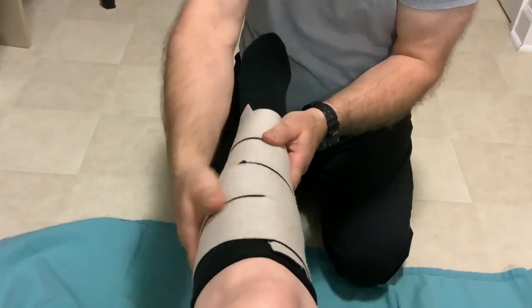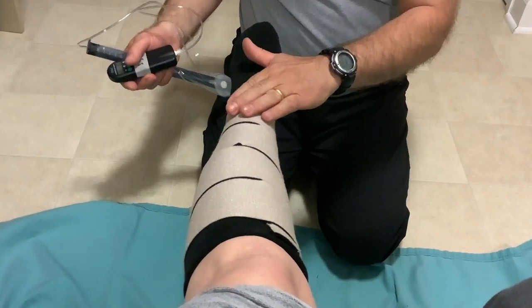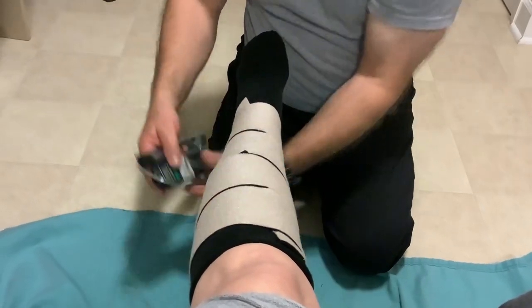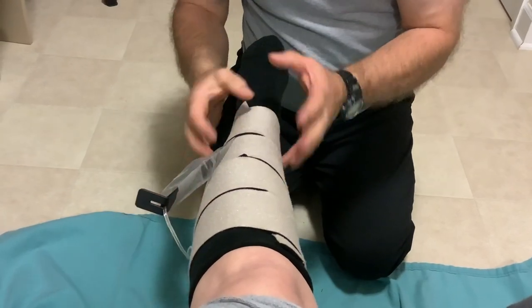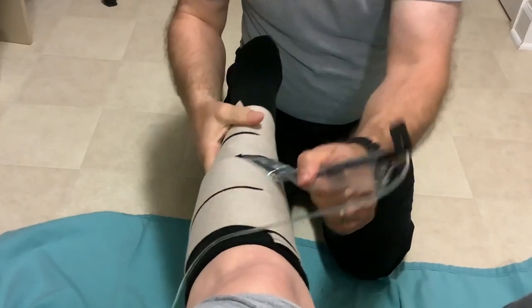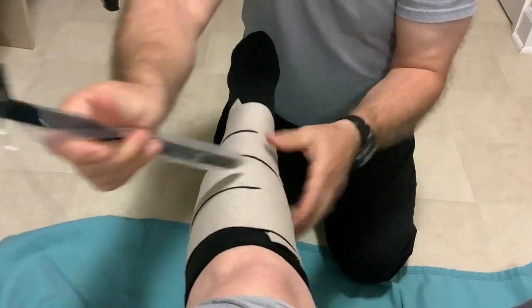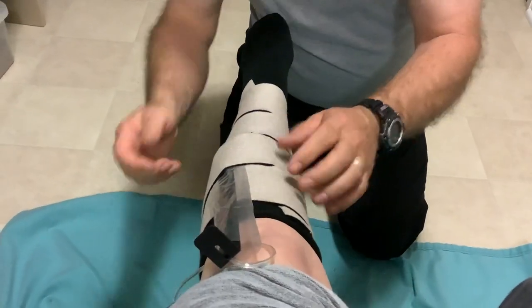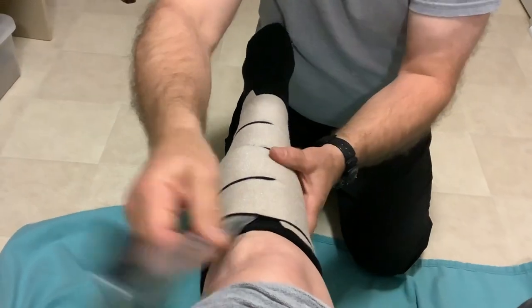Once you get them all where you want them, you can use the Juzo pressure monitor to check your pressures. You want higher pressure at the bottom, with lower pressure moving upward — that gives you a gradient pressure. I like to do the lateral side, targeting around 45–50 on the lowest strap, then slowly backing down the pressures to about 30 on the very top one. I'm at 28 on this last one, which is just fine.